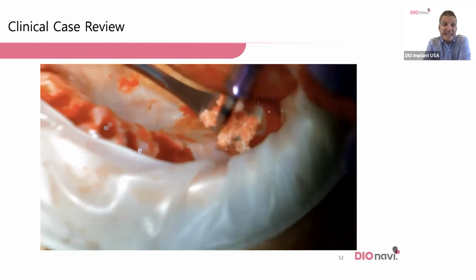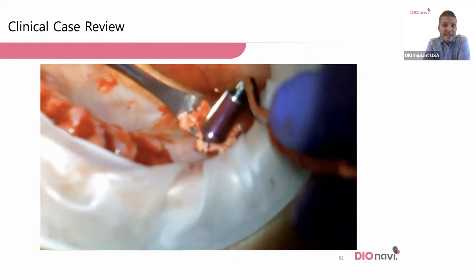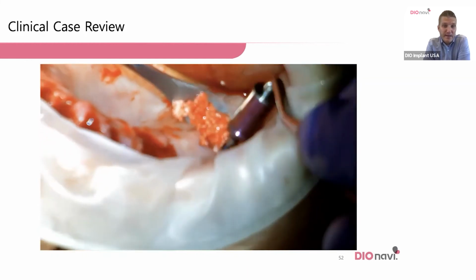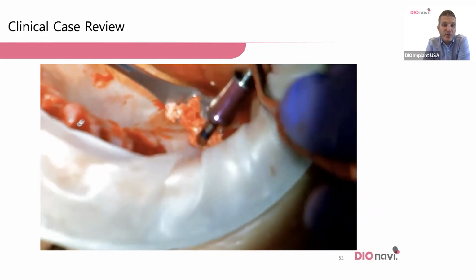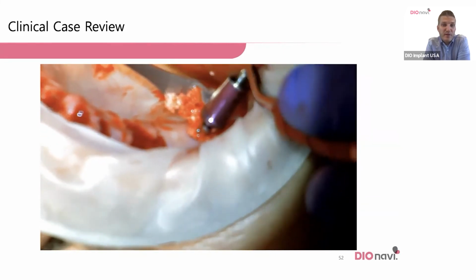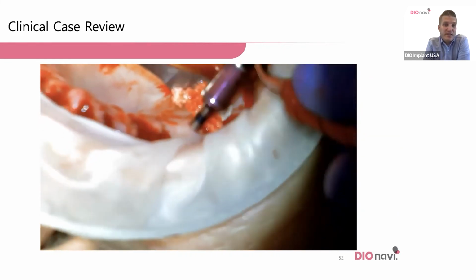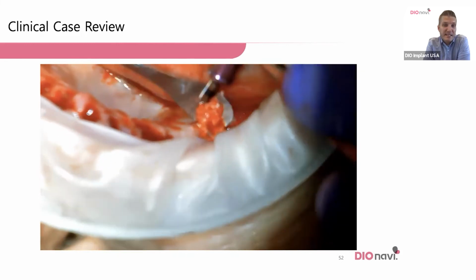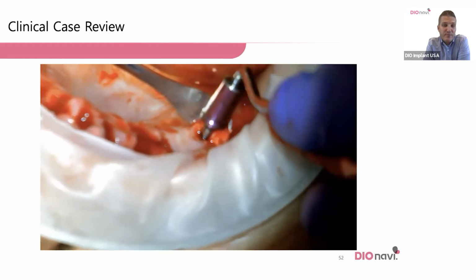So that's a cc of bone. And I typically place half of it and then take a PA, and I determine if I want to place any more. I was filming this. I went ahead and just placed all of it. You're going to see this takes a little bit of a second, but I placed every bit of 1 cc, and then I put the implant in.